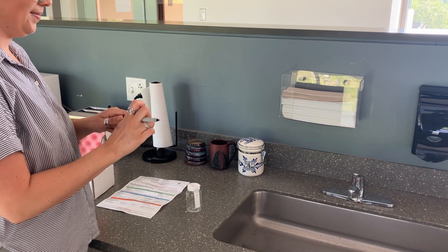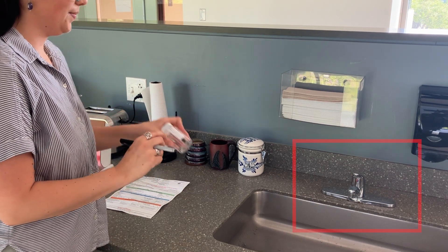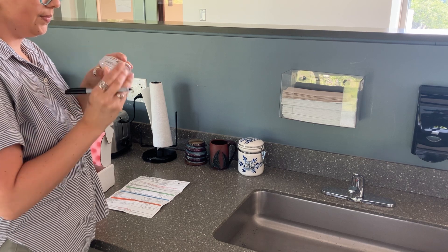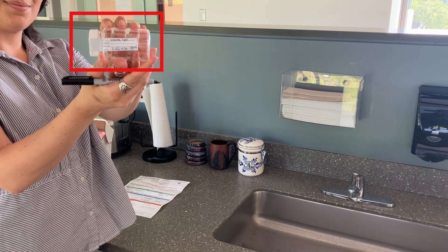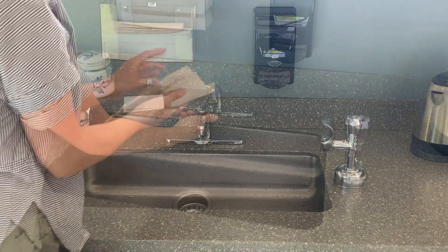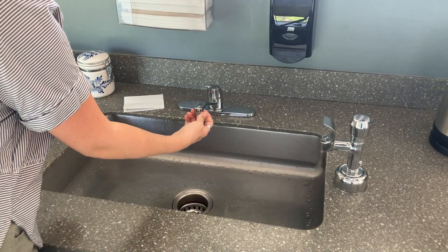Now, prepare to collect your sample. You'll want to use the faucet you normally drink from. Write your name and phone number on the bottle's label — this is how the lab will know the sample belongs to you. Next, wash your hands before collecting the sample. Carefully remove the faucet strainer.